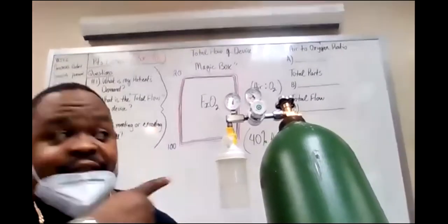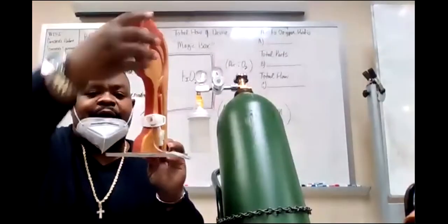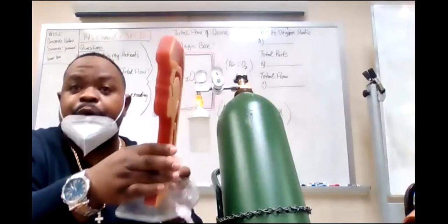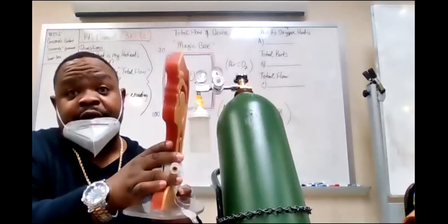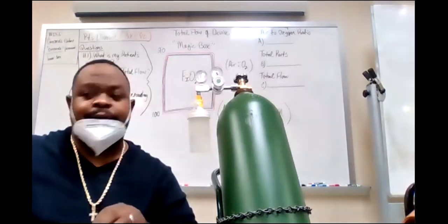Remember, the nose does this. That's what the nose is supposed to do. But just think, Mr. Johnson has a trach, right? Like this gentleman over here has. There is no nose right here, right? So the air that's going in here is pure dry. And we said that medical oxygen is extremely dry. So if I don't put some water on it, it's going to dry him out, right?